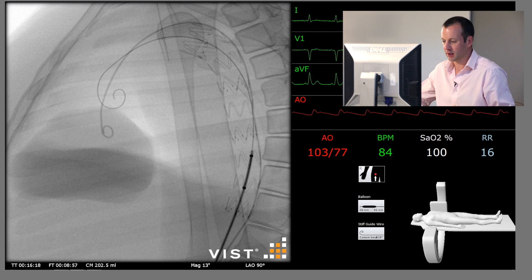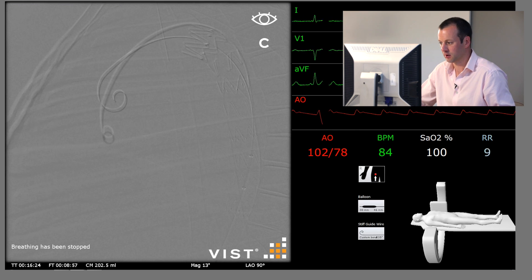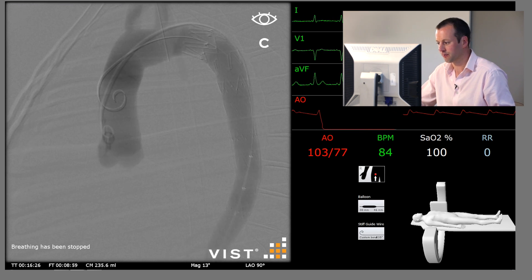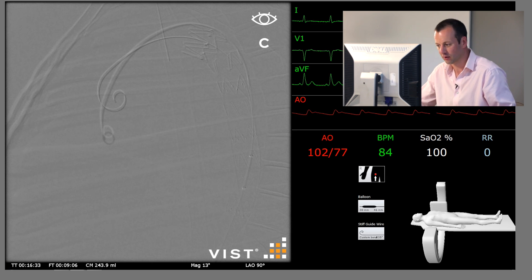We'll now repeat the angiogram having molded the proximal and distal ends of the stent graft, with a breath hold. A flush injection demonstrates exclusion of the ruptured aneurysm and rapid flow through the stented segment.